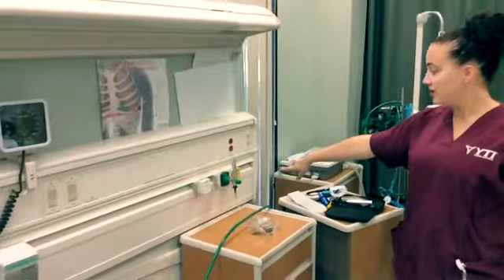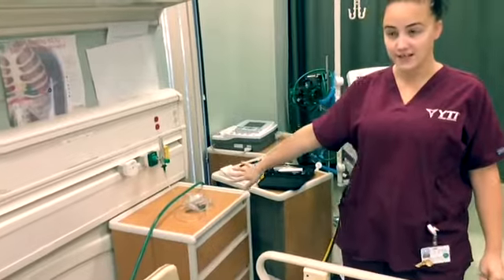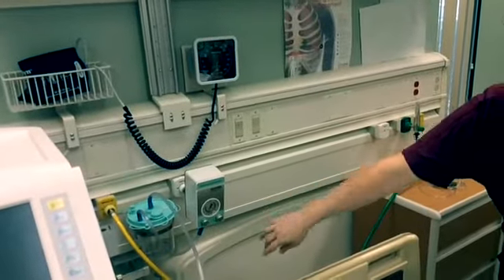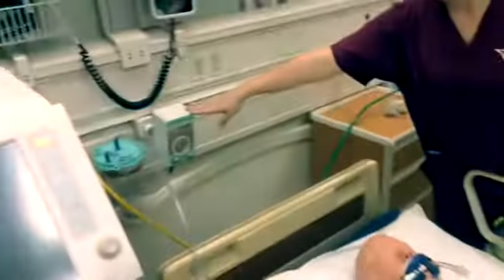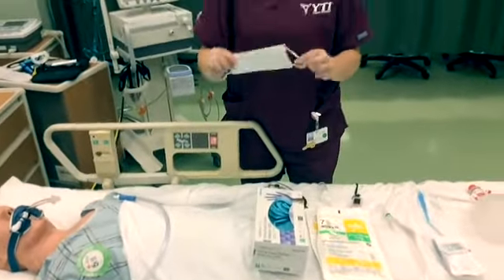The supplies that you're going to need for nasotracheal suctioning and endotracheal suctioning are as follows. We have our oxygen with our flow meter and a non-rebreather for emergencies. We have our suction canister with our suction tubing and our suction adjuster here. We have our masks.